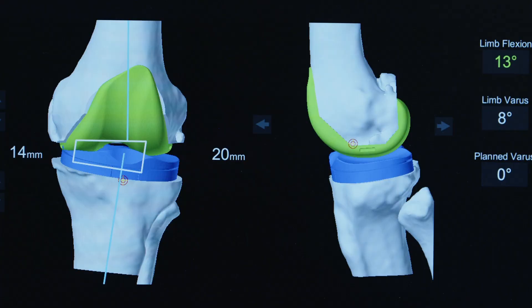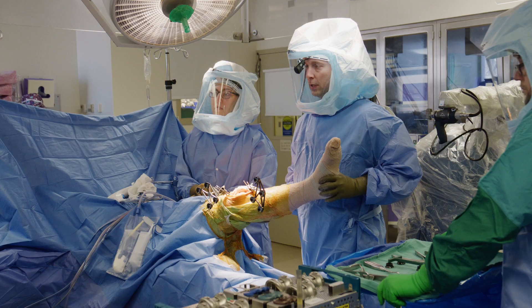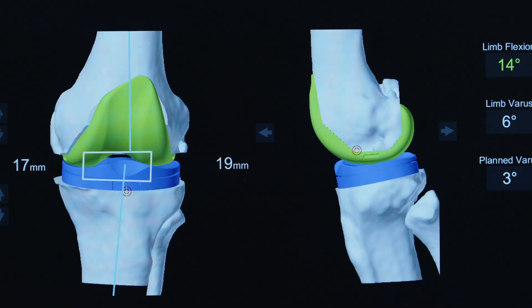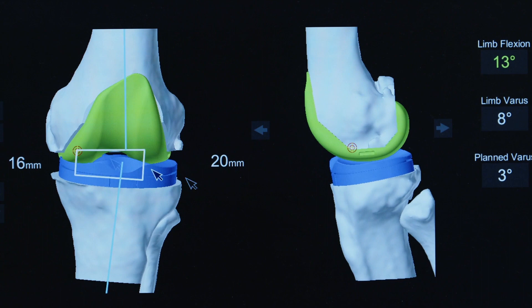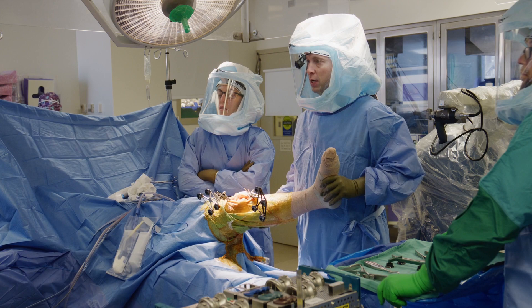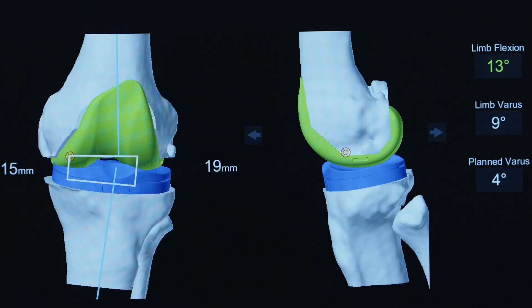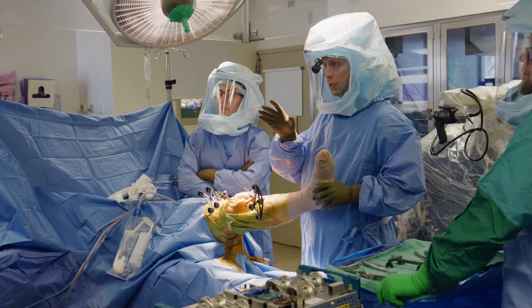Let's lock it in the middle and give me two degrees. 17 and 20. Why don't you give me one more in the middle? And on the femur side, lock it medially — give me one of varus. So we're getting close. We want 19 or 20 millimeters, somewhere in that range, and we're getting pretty close. What we just did there was we adjusted the shape of the components or adjusted the angle in order to accomplish our goal.